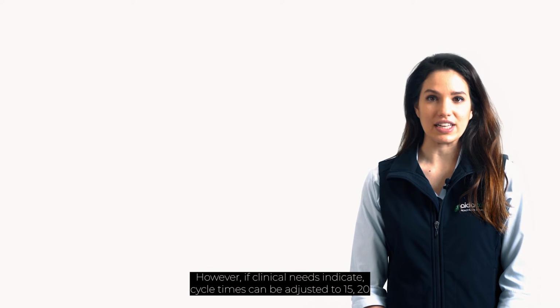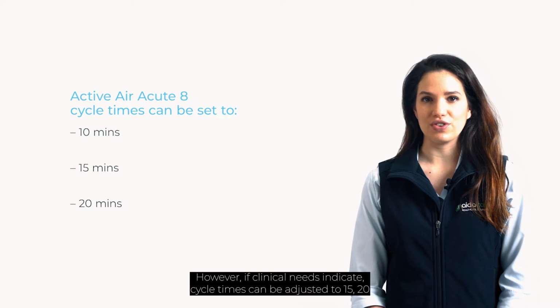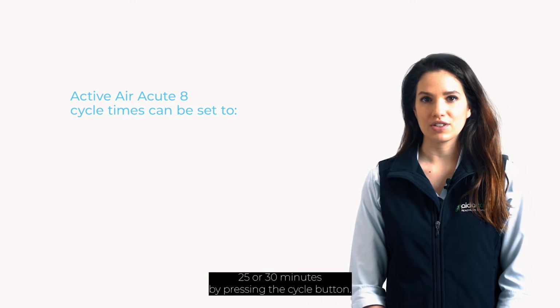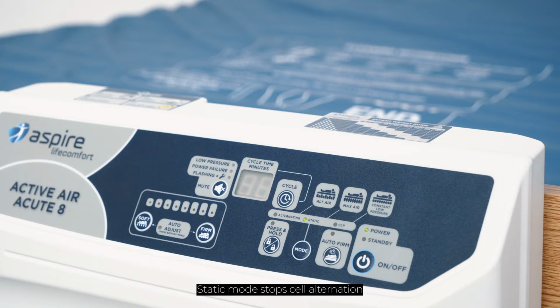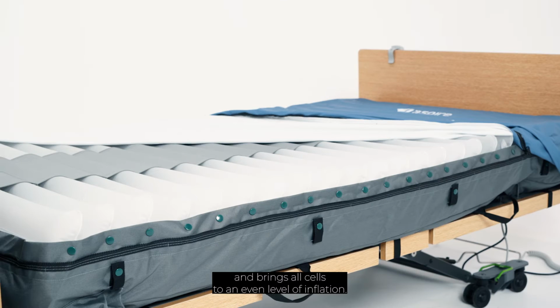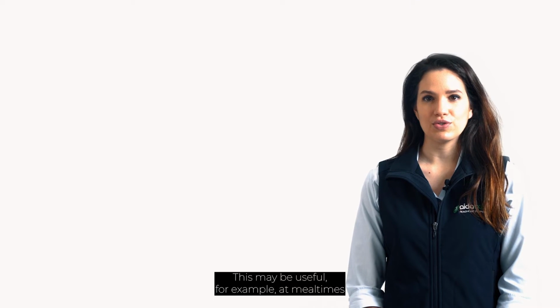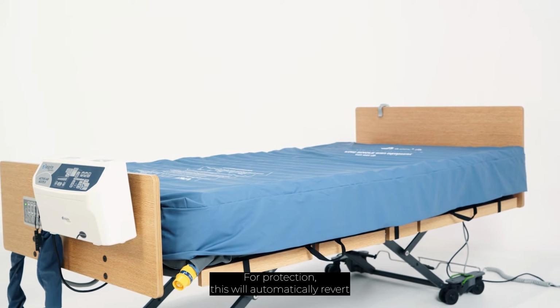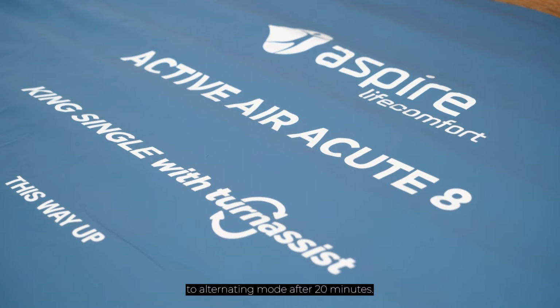However, if clinical needs indicate, cycle time can be adjusted to 15, 20, 25 or 30 minutes by pressing the cycle button. Static mode stops cell alternation and brings all cells to an even level of inflation. This may be useful, for example, at meal times when the user wants a static surface. For protection, this will automatically revert to alternating mode after 20 minutes.